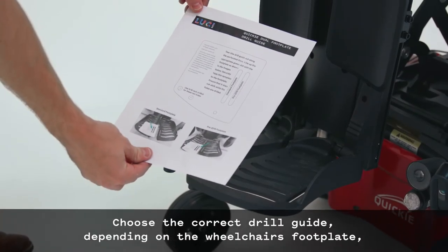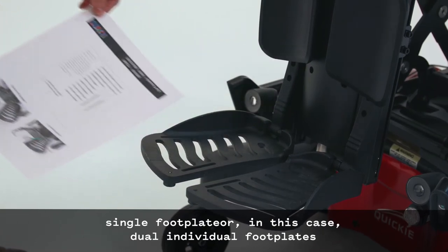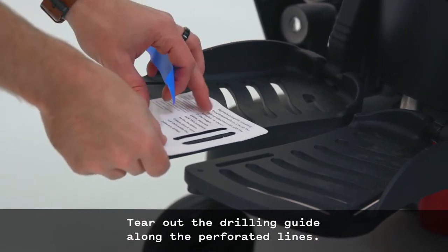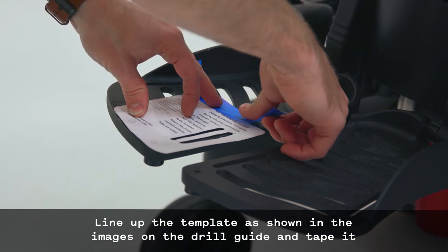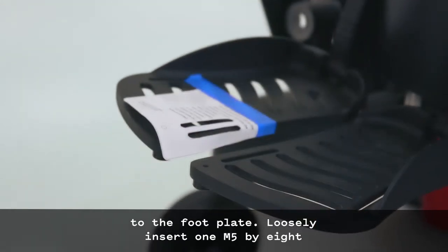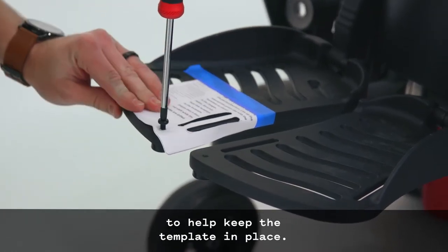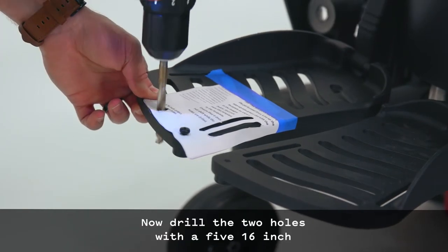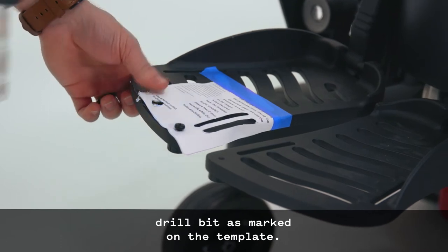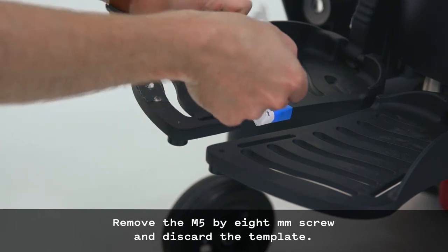Choose the correct drill guide depending on the wheelchair's footplate — single footplate or dual individual footplates. Tear out the drilling guide along the perforated lines. Line up the template as shown in the images on the drill guide and tape it to the footplate. Loosely insert one M5 x 8mm Phillips-head screw through the template and into the threaded hole to help keep the template in place. Now drill the two holes with a 5/16-inch drill bit as marked on the template. Remove the M5 x 8mm screw and discard the template.